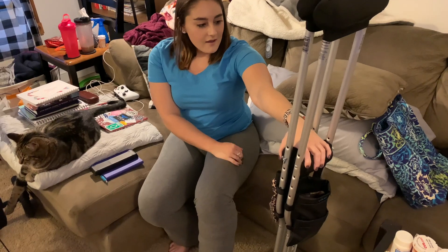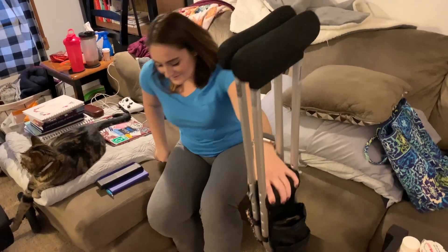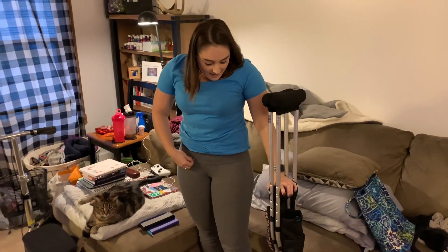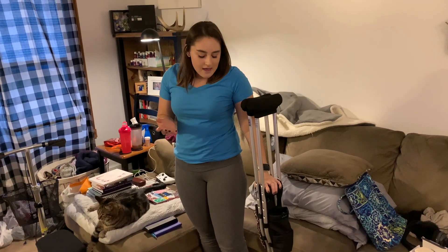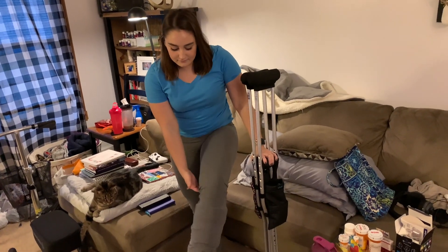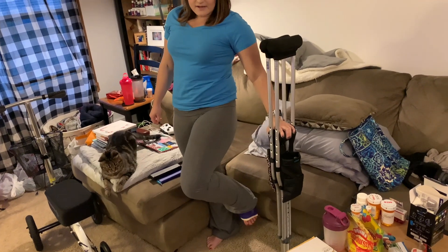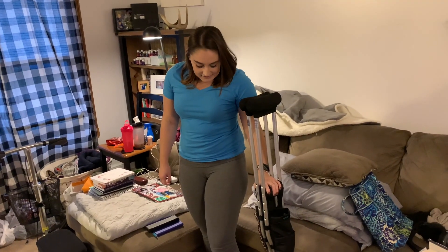All of my weight has to go on my right leg. Pretty much just stand up using your right leg. As you can see my left leg is resting on the ground right now because it does get tiring holding it up — there's some muscle back there, I forget what it's called, that gets very sore from holding my leg up constantly.